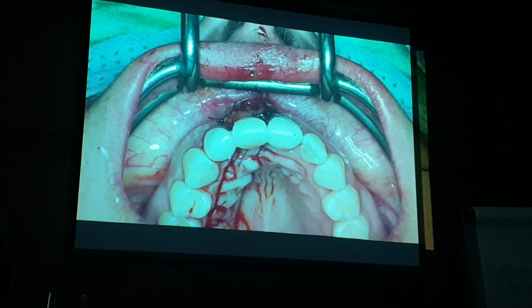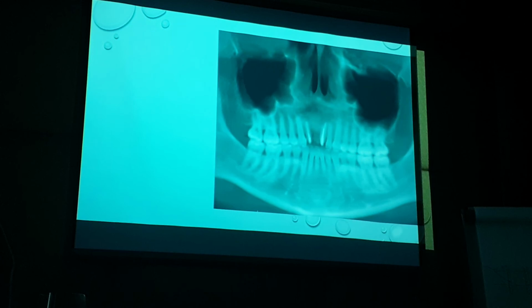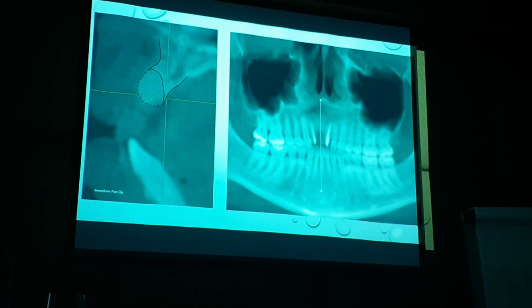This is from the palate. From the palate. But it's still connected at this space right here. We've taken it, we've split thickness inside, we've pulled this underneath and rotated this over the facial bed. That's what it looks like with the bone graft.